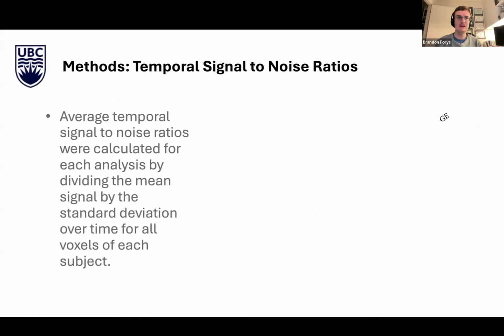So then we were able to calculate temporal signal to noise ratio.